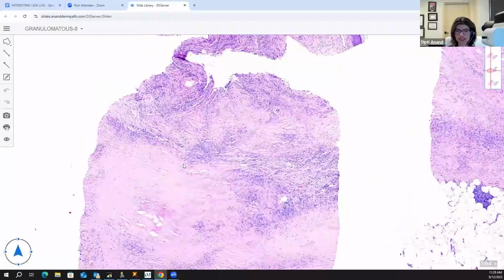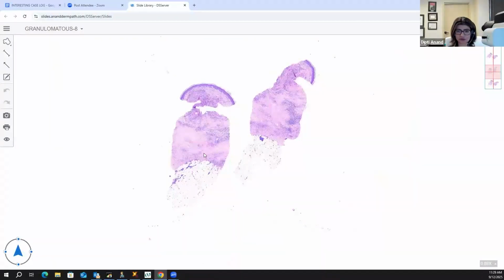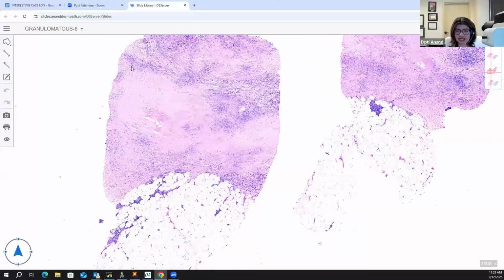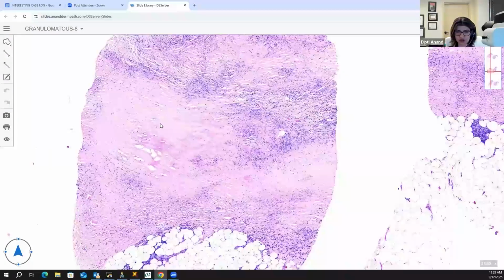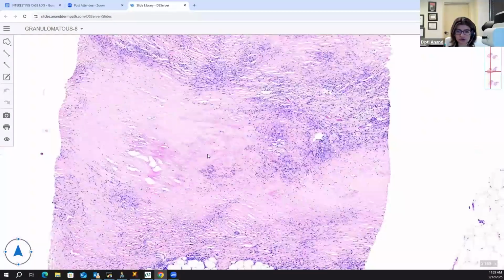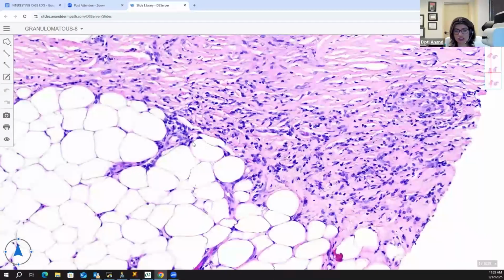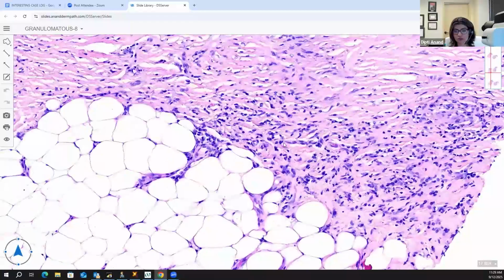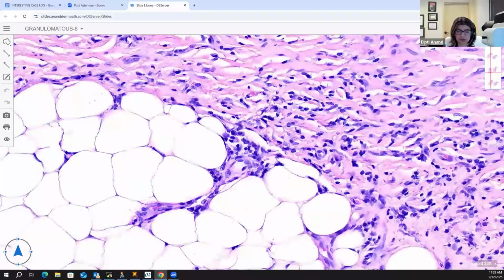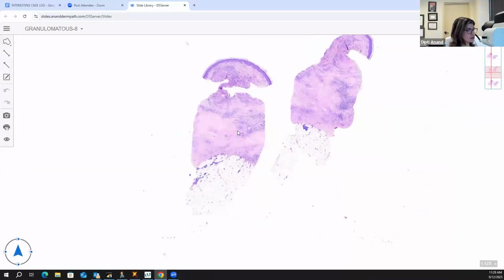So you have the nice layers of a cake. This is a classic biopsy. It involves the breadth and the depth of the biopsy. And you see the nice palisaded granulomas with the layering of the cake. The cream of the cake is a beautiful sclerotic collagen. And often at the junction of the dermis and the subcutaneous tissue, you often see plasma cells at the leading edge of the biopsy. So that is NLD. Everybody good with that?